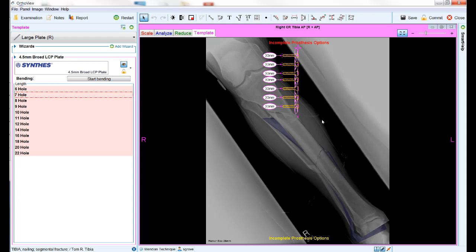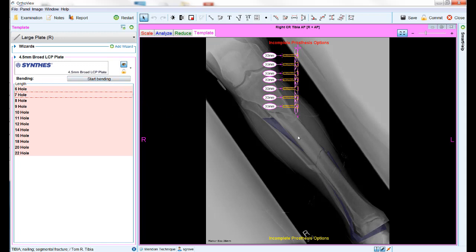Once you are happy with the reduction, move on to the templating tab. Here you will see your default implant with all its options, and you can begin to make choices on those options as well as click on the template banner to select an alternative. Unlike planning for hip, knee, and shoulder elective procedures, there are no positioning wizards used in fracture management, so the template size defaults to the size chosen the last time you use the implant, and the templates are placed in the center of the screen ready for manual positioning and resizing.